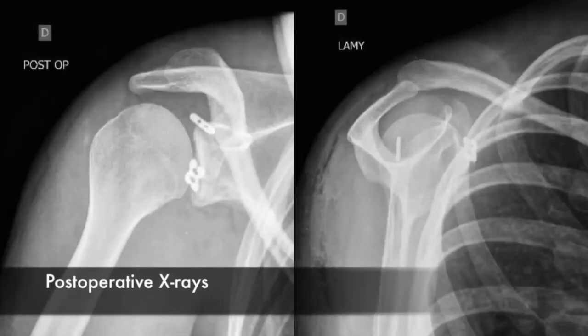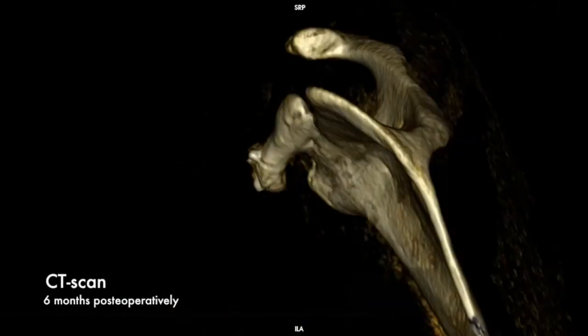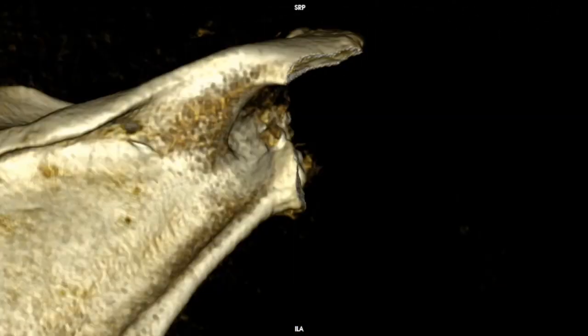Skin is then closed in routine fashion and the patient placed into a simple sling. At 6 months postoperatively, the altered position of the coracoid can be visualized in its healed position.